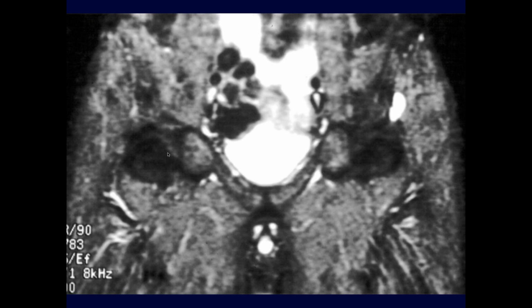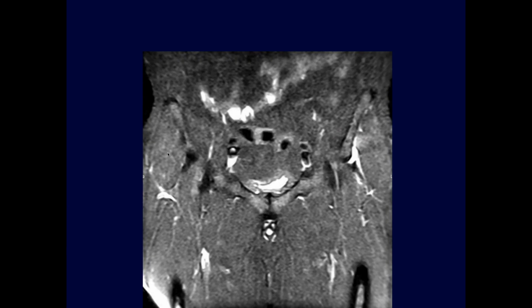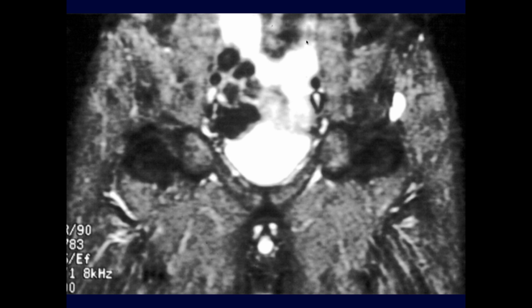Okay, so kind of superior to the left hip, I see a small circumscribed fluid collection. I believe this is a STIR image. And now I still see some kind of similar region where that fluid collection is. And in that region, you can get things like paralabral cysts. Okay, so if we look back here, maybe that's a paralabral cyst. So you want to go back and look at the labrum. Mm-hmm. The labrum looked pretty good here. The labrum looked pretty good, okay.